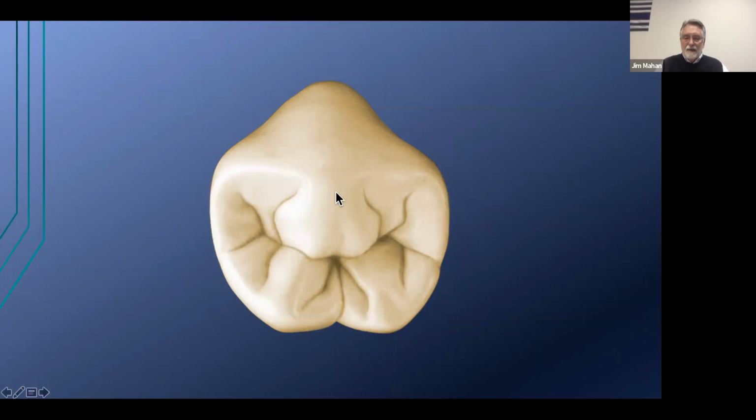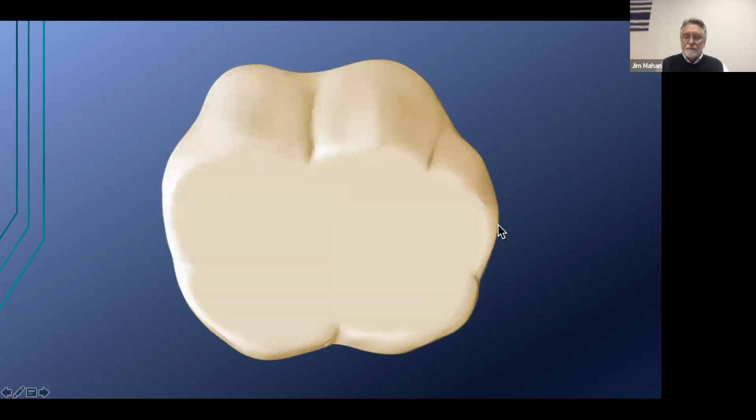Now, if we bring it up, that's the tooth that we just drew. If I say this is the top of the ridge and this is the adjacent groove, this cusp tip is going to be very close to being right there. Now, on this tooth, the way it was carved probably 40 years ago, it goes in a tiny bit more. Okay, well, if it's not exactly there, is it okay to do that? That starts to become the artistry and the signature of the technician, let's say. But we know it when we see it.